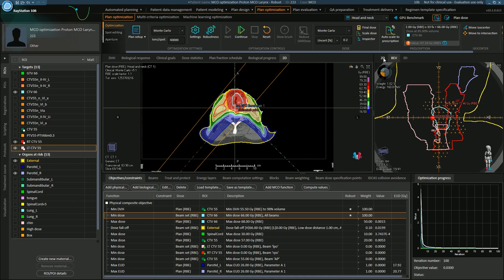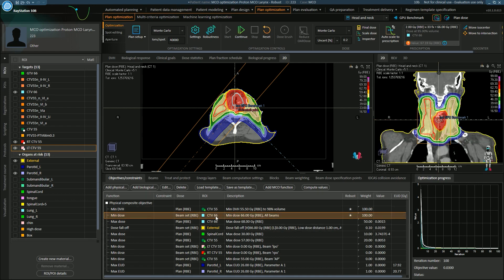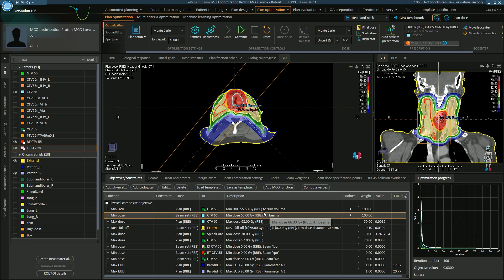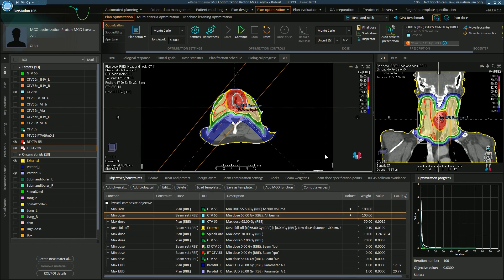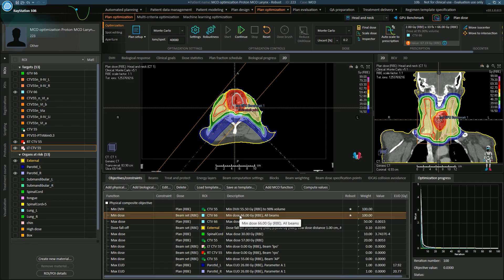That might look a little bit strange, but remember we're looking at the CTV. In proton planning, the PTV is not appropriate because it does not cover all of the uncertainties that can occur. Instead, we use robust optimization on the CTV. In the robust optimization, we define the uncertainties that can occur that can reduce dose within the CTV. We look at our objective functions and define which objective functions need to be robust against uncertainty. In this case, I've selected the minimum dose to CTV66 and CTV55.